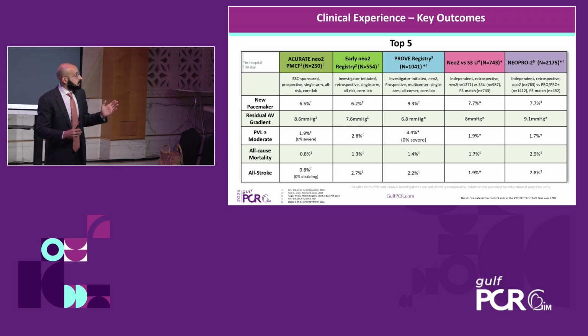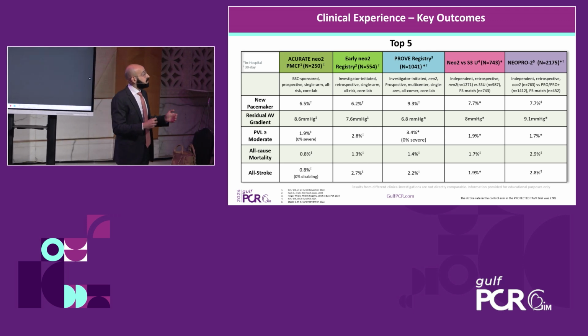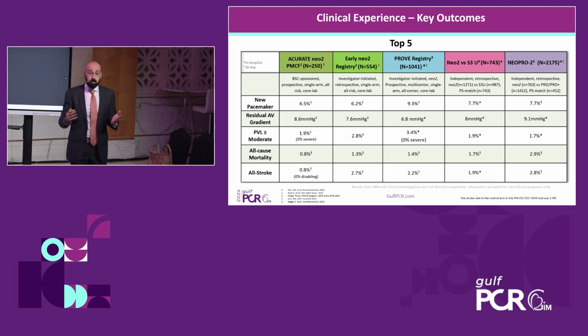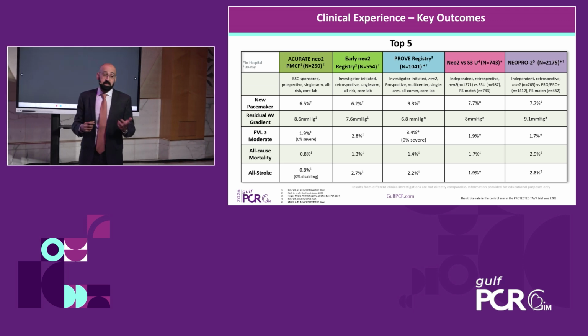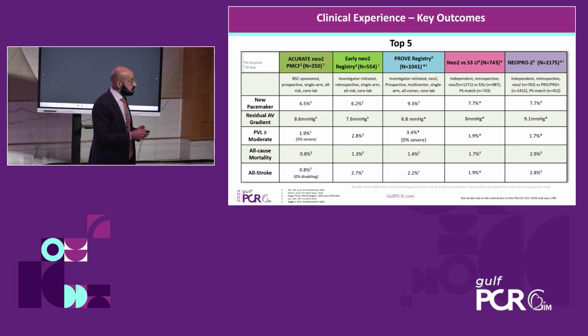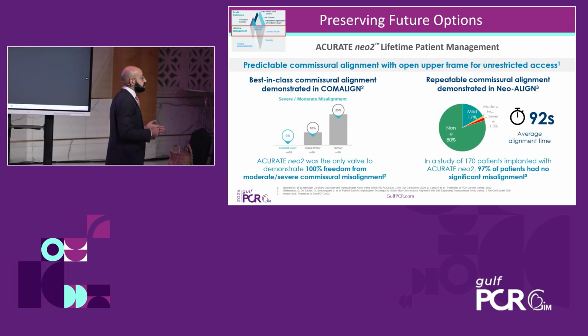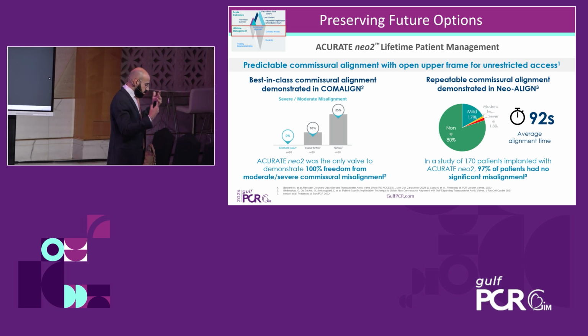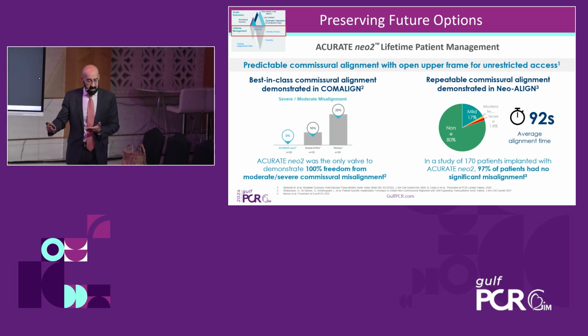You get very low to moderate PVL in the 2% range, and you get probably similar all-cause mortality and stroke compared to the commercially available valves in the market. These are 30-day outcomes. So when we plan our TAVI, we need to think about lifetime management.